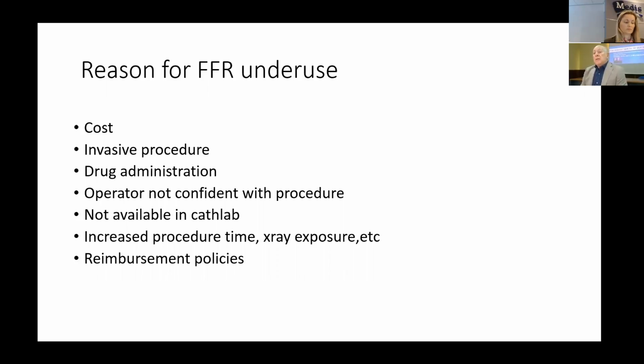You need drug administration, and maybe sometimes the operator is not confident with the procedure, and sometimes it is not available in the cath lab. This is an important issue, because I think that the cath lab today must have a functional evaluation tool, and it leads to times and reimbursement issues all around Europe. In some countries you get reimbursement, in others not.